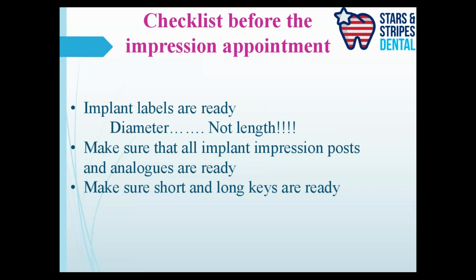So make sure you have a checklist printed out and stick it somewhere so you can see it, train your staff properly, and arrange all the parts beforehand, before the patient comes. Okay, so it becomes a smooth, tension-free experience for you.